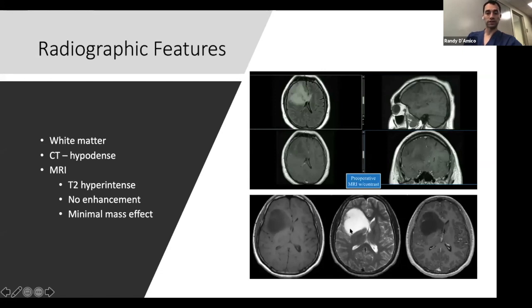Then we look for contrast enhancement or the lack thereof. So this is a T1 weighted MRI image, which is used best to look at normal anatomy, and you see it's hypointense. When we talk about MRI, we talk about intensity, not density, all right? And this image over here is a T1-based image, but they've injected gadolinium, a contrast agent.